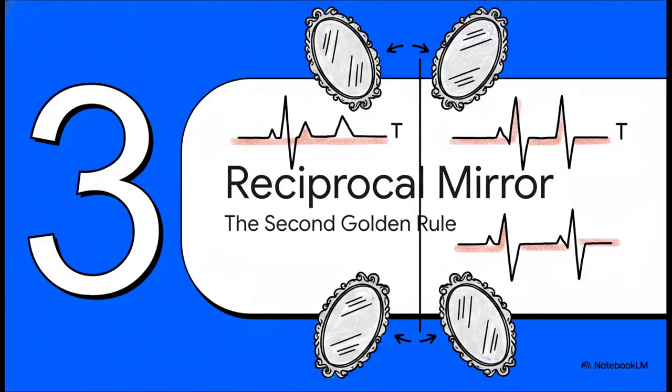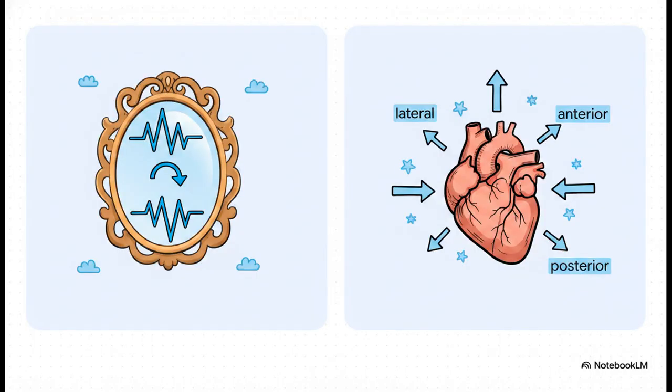Section 3, the reciprocal mirror. Because, honestly, territoriality is only half the story. Remember, the heart is a three-dimensional object, right? So if one territory is actively infarcting and throwing up an ST elevation, the leads looking at the exact opposite wall of the heart are going to act like a mirror. They'll pick up that same electrical signal but in reverse, which shows up as ST depression.